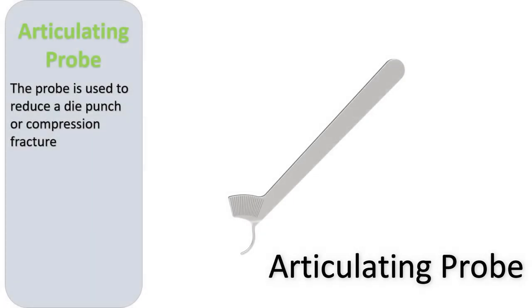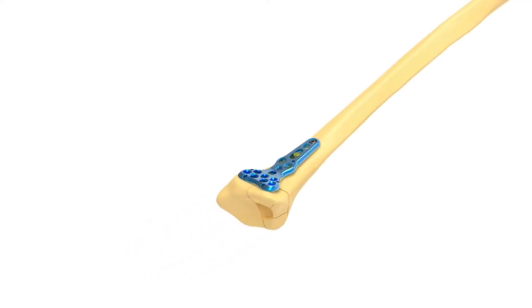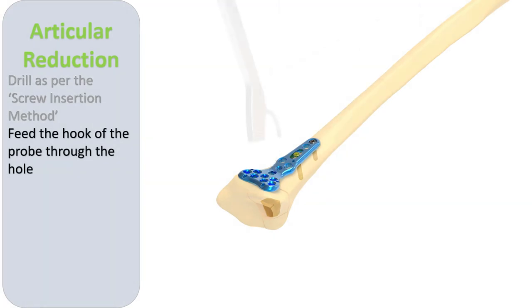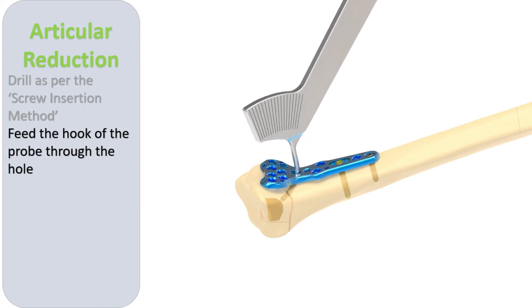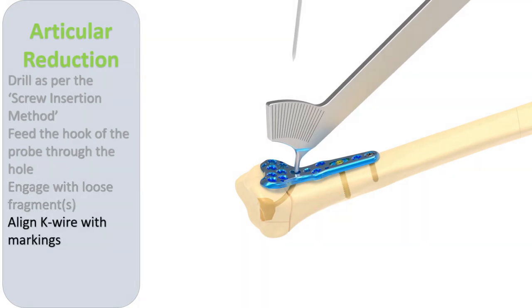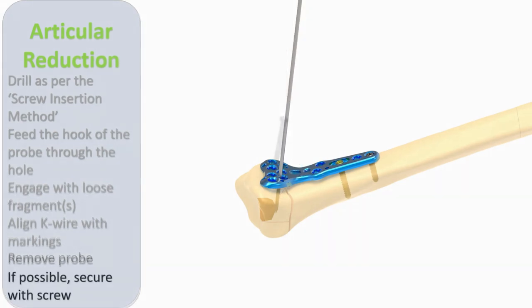Elevating depressed intraarticular fractures is aided by using the articulating probe. An empty screw hole in the plate proximal fragment is selected and a drill hole made through this hole in the anterior cortex of the radius. The hook of the probe is then fed through the hole. A K wire is then passed through an adjacent hole parallel to any one of the radial lines on the guided articular probe, aiding in stabilizing the depressed fragment while further screws are placed to maintain stability.